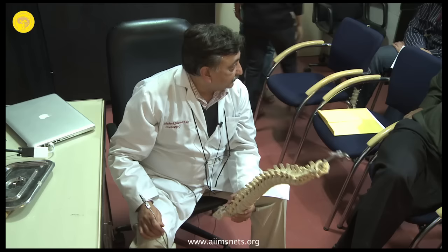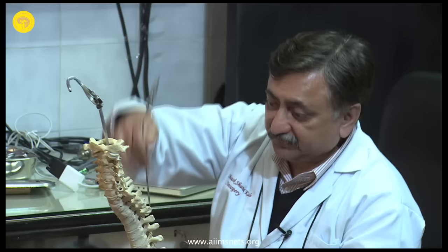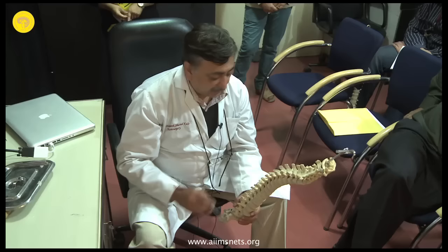But in the lumbar spine, you need a three column support, because all the body's weight is transferred ultimately through the spine. And as you go down, the loading is more and more. So the lumbar pedicle screw insertion is the most important. Second is the thoracic, and cervical, you can practically forget about it. It's usually not needed. Now, how do you put a lumbar pedicle screw?